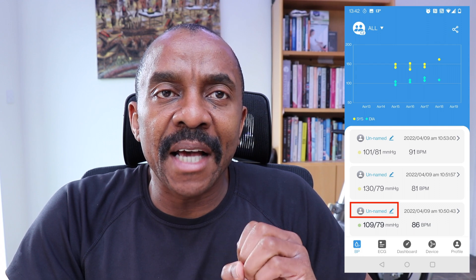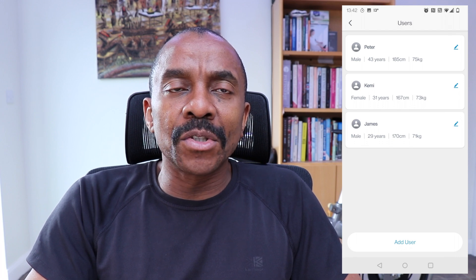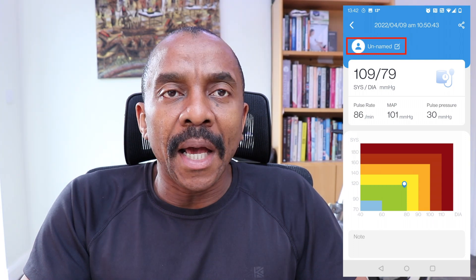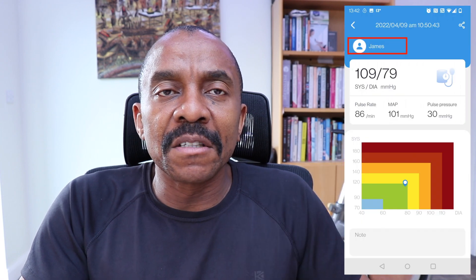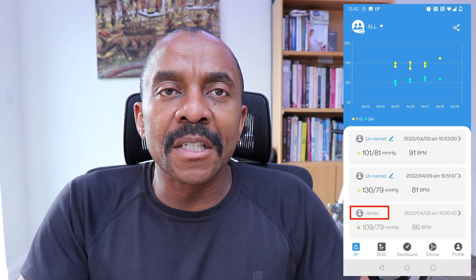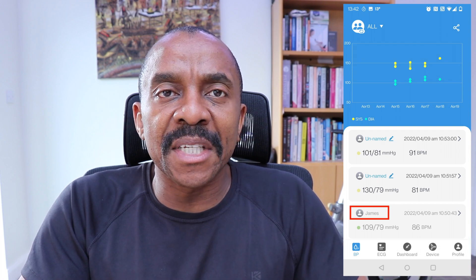When you take a blood pressure reading on the device, it's actually registered as an anonymous reading. You can then go into the app and assign that reading to anybody that is registered on the app. You can register as many users as you want. When you want to assign a reading to somebody, through this interface you select the person — let's say we select James for a particular reading. James would then appear registered against that reading, and you would see that there are other readings that are yet to be assigned to other individuals.